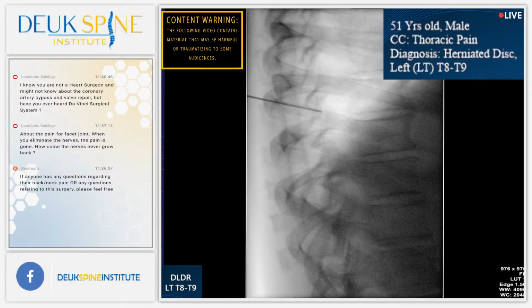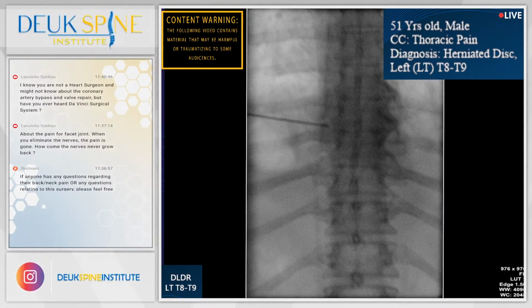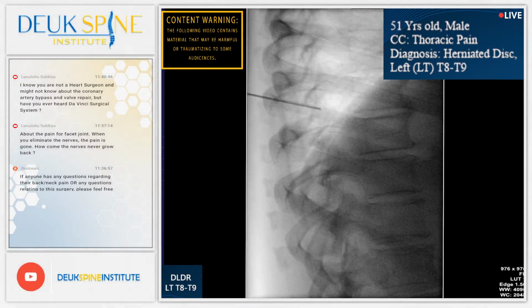AP. May have to start more medial on him. And that looks good, but I'm hitting bone. I'm hitting that rib head. That's got to be what it is.